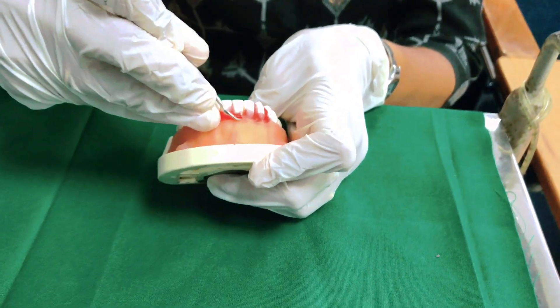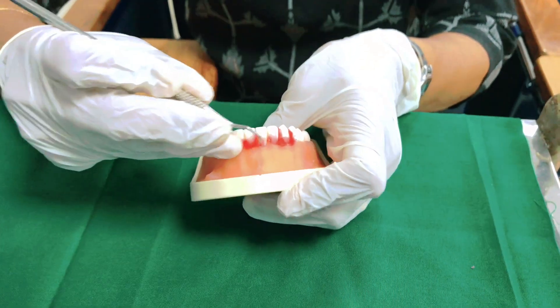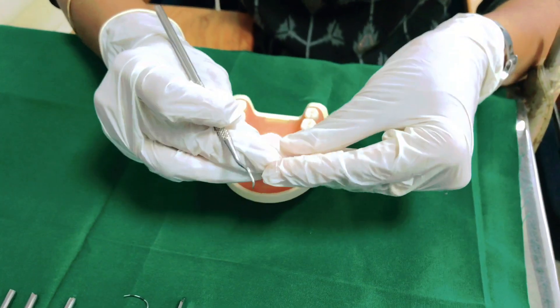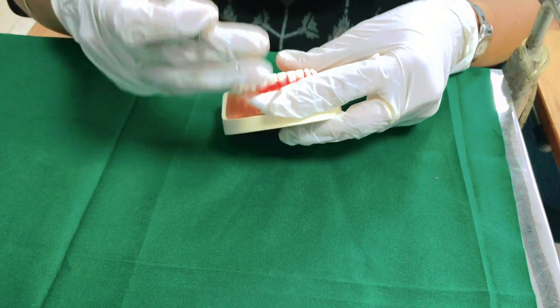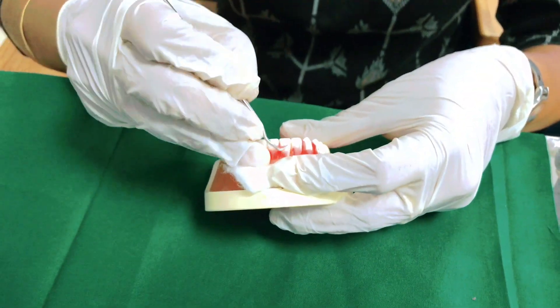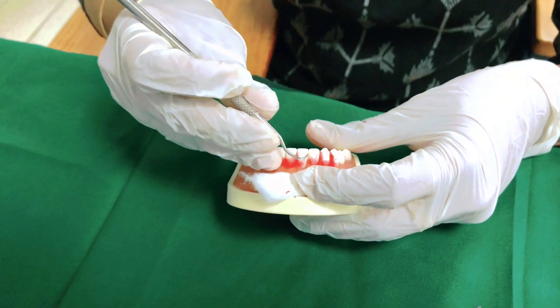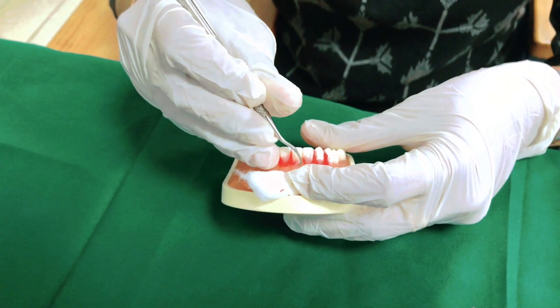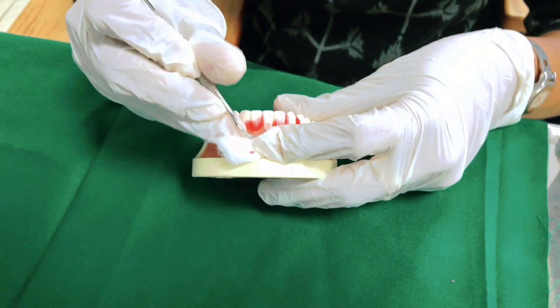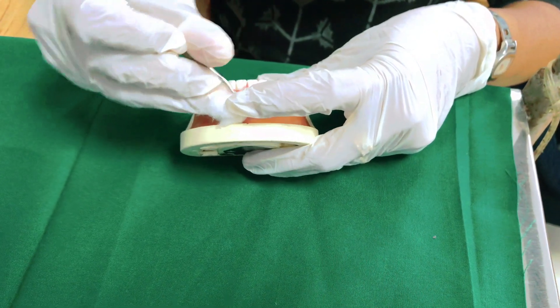Once you have removed the calculus, you can also tilt the instrument. Meanwhile, the debris can be removed with the help of cotton placed nearby — imagine your lip is down here. Remove the calculus from this side, then for the other side just turn your instrument — using the lateral surface — to remove the calculus. Ensure that the calculus is completely removed, and use cotton to remove any remaining debris.